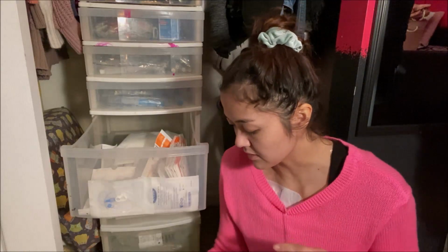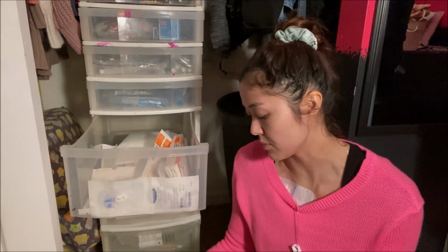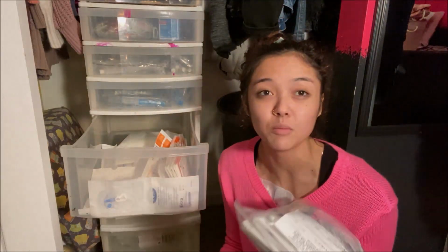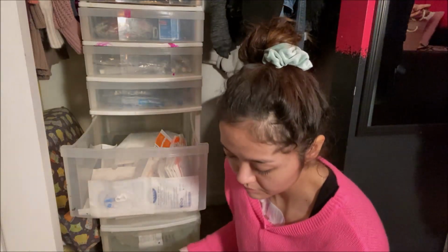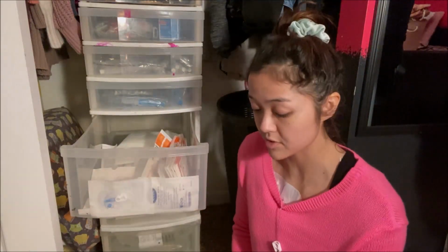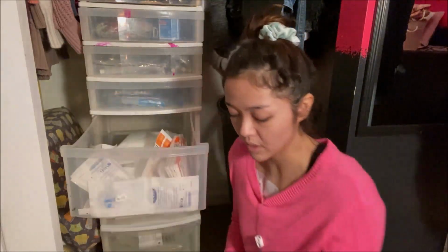But the lines are a little bit too long and it takes longer to access my port and add an extension. It's just more time consuming than helpful. So I don't really use them anymore. But I have a bunch. And, oh, thankfully they did not send me extensions this time, so hopefully it stays that way.